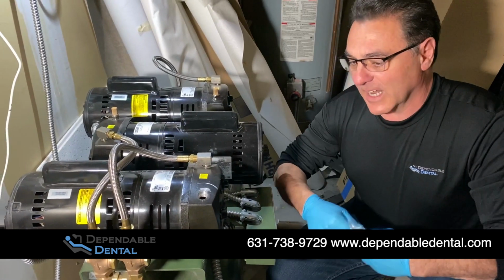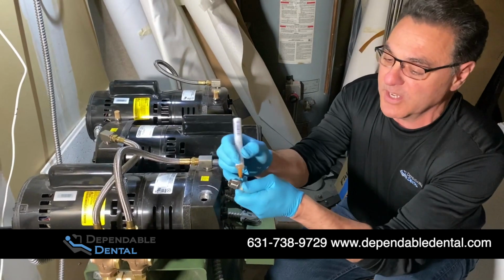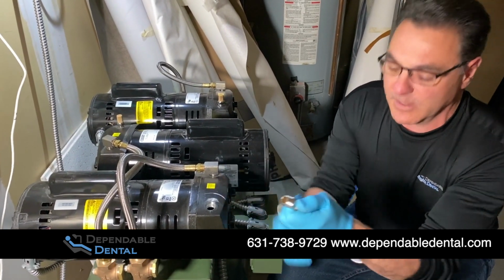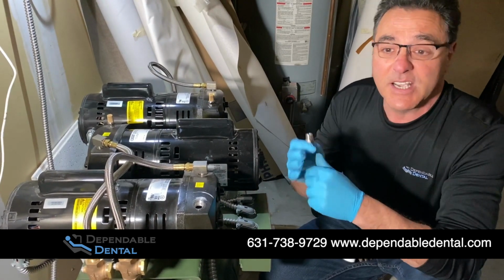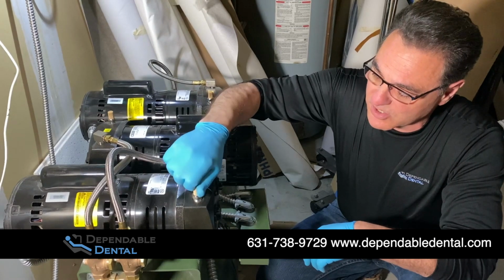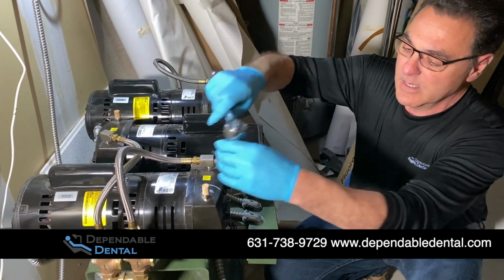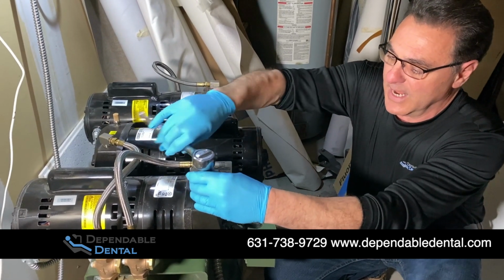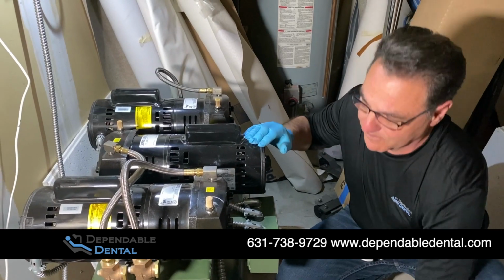What I like to do before putting the muffler in is put a dab of WD-40 on it. The reason we're putting the WD-40 on it is so when we come back next year to change this, it doesn't strip the head, and it's a much smoother insertion. So we're going to screw it in by hand as far as it'll go, and then turn it just a couple of turns till it's snug. You don't have to gorilla it tight.